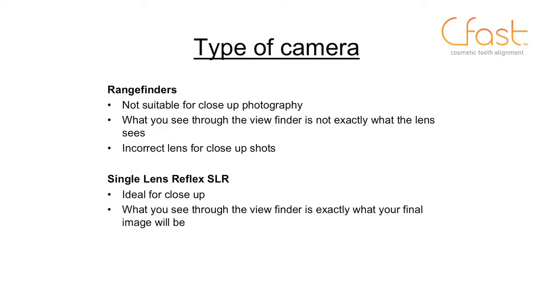I think it's essential that we're clear that we need to be using a digital SLR, single lens reflex camera. Rangefinders, prosumer cameras, the difficulty is taking the consistency of the shot that we're going to be taking, and we're going to look at that. And really, these shots are very repeatable and the same every single time. And to be able to achieve that, we need the SLR. The rangefinders, they're not suitable for close-up. You're not exactly getting a true reflection of what you see through the lens is actually what you're getting as the image. And it's not going to give you the same close-up shots. Whereas the SLR camera looks more complicated, but ultimately is going to give you a much more consistent view.